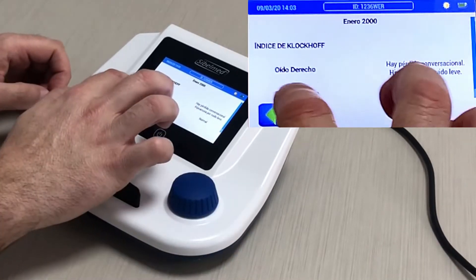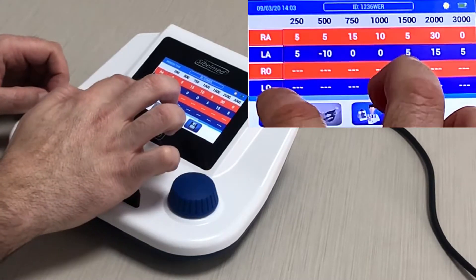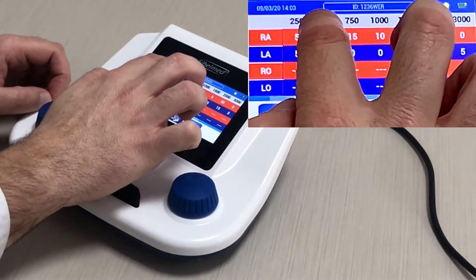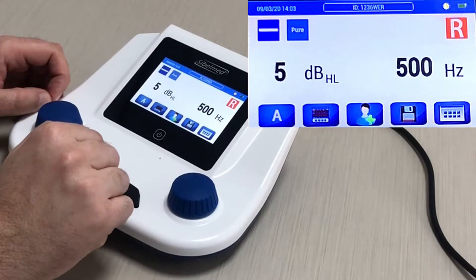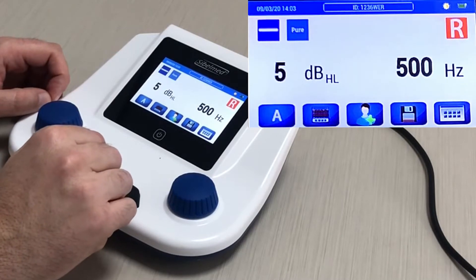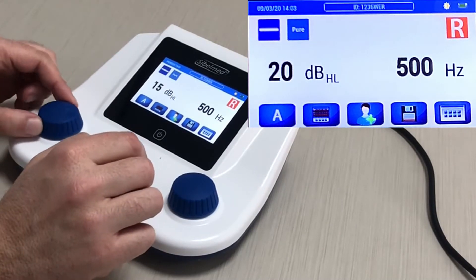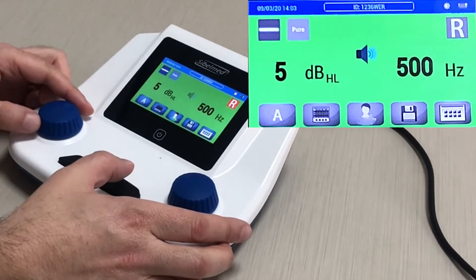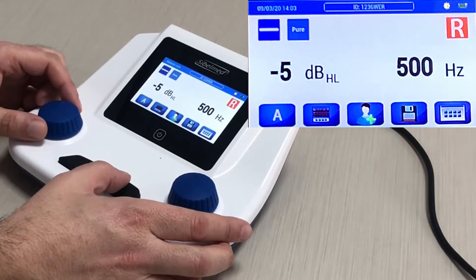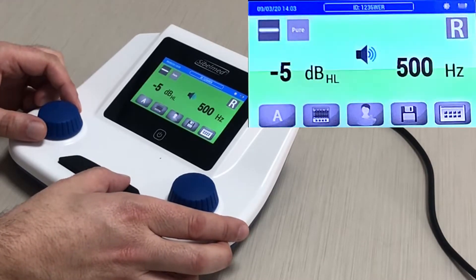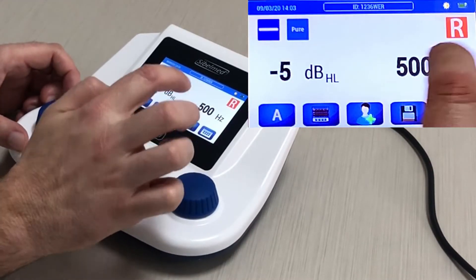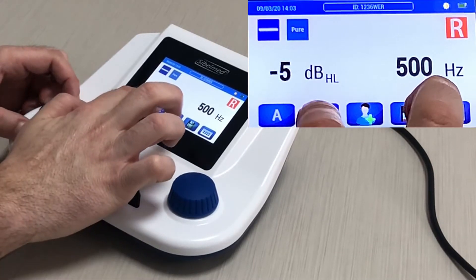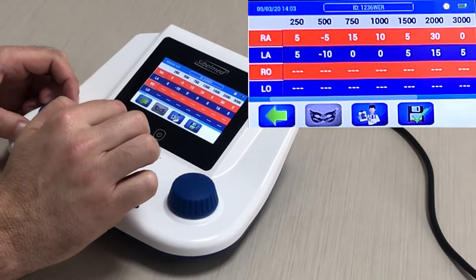If we want to repeat some of the explored thresholds, we can directly access them by pressing the value we want to modify. We save again and go back to see how the value is updated on the results screen.